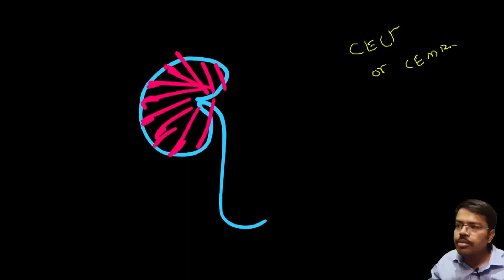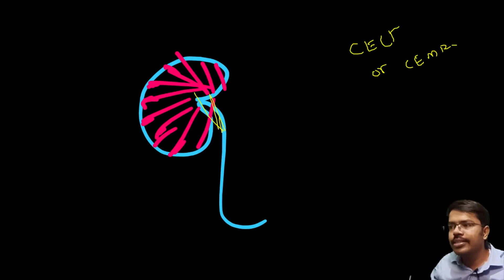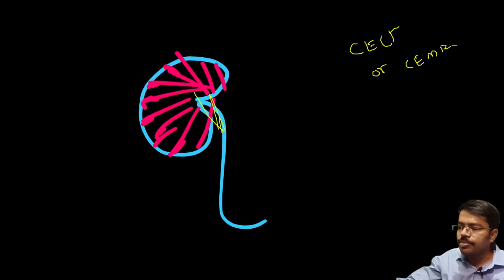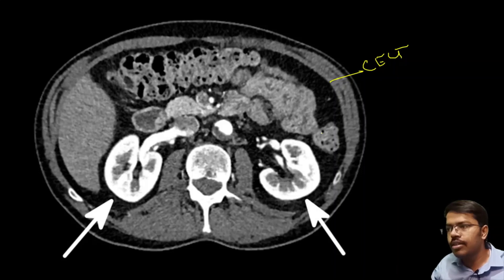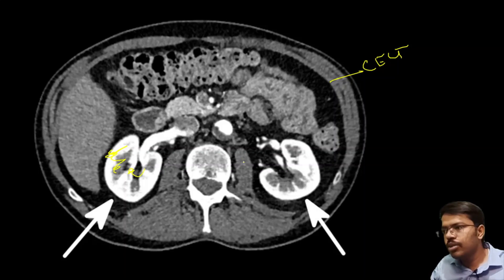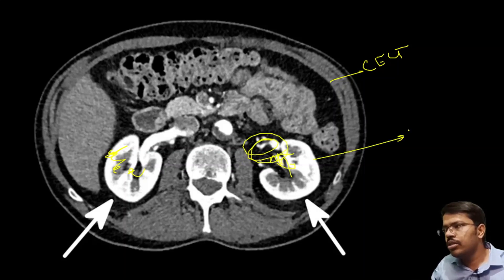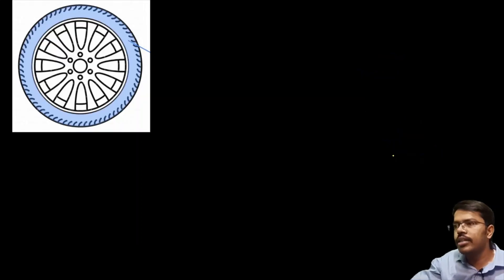Both the cortex and medulla get enhanced and the contrast gets excreted through the collecting system. This is a normal contrast-enhanced CT of the KUB, just to show the normal enhancement of the cortex, subsequently the medulla, then the contrast goes into the excretory system. This is normal enhancement of the kidney.